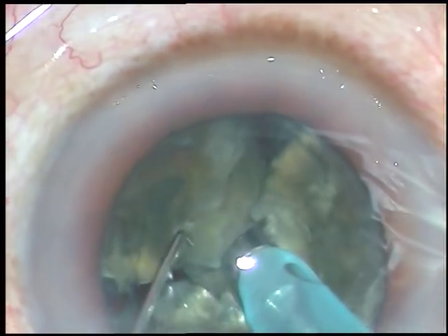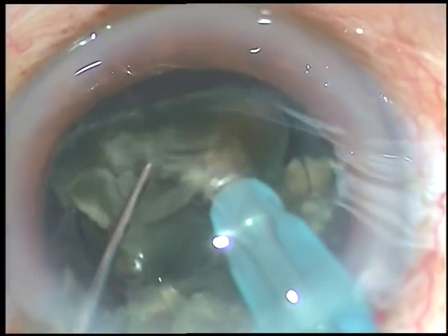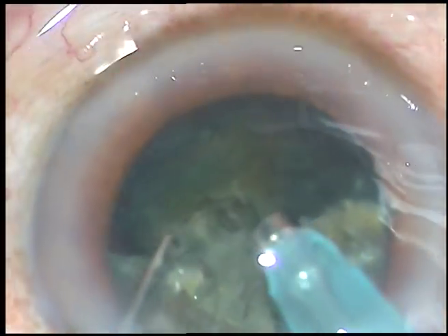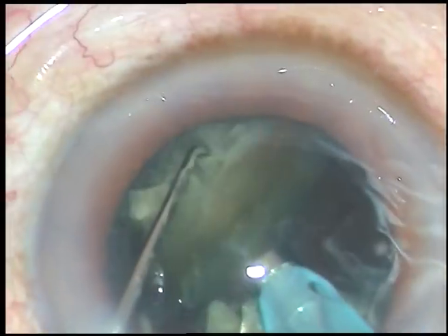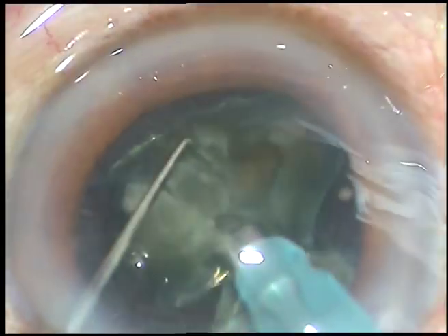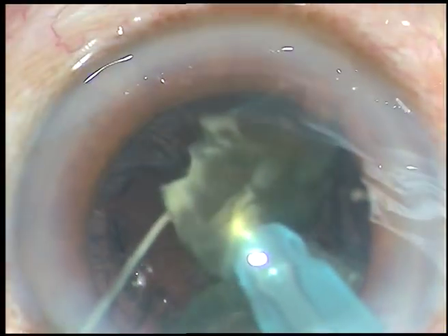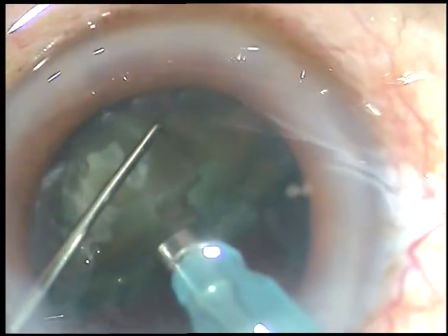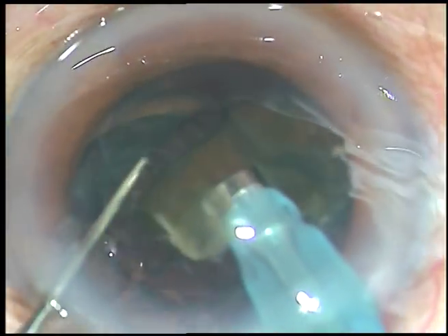Each nuclear fragment is worked on with ultrasonic energy, emulsified and removed. There is no chattering of the nuclear pieces. The nuclear pieces always remain around the tip, around the aspirating port of the FACO handpiece. It doesn't go here and there, and thus you protect the corneal endothelium.